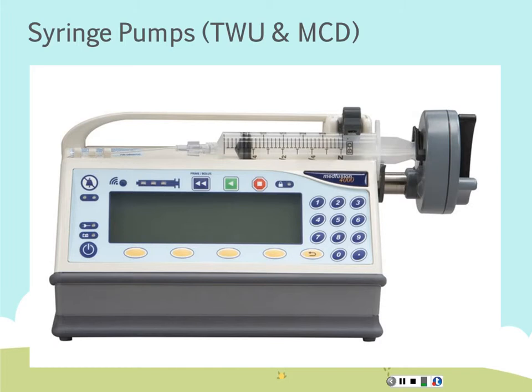When we're looking at direct IV push in kids, we're typically reserving it for emergency situations. If they're coding, or if you've got a kid with a prolonged seizure, where you need therapeutic medication levels backed up quickly to get the desired effect in place and to stop the seizures, that's one of the only ways that we would use IV push in kids. The rest of the time we're going to be using a syringe pump. So what you're seeing right here is one of the syringe pumps that's primarily used.